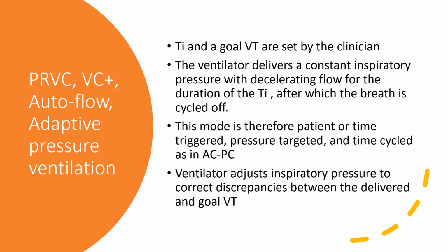So the point is this: it's a lung protective strategy. The inspiratory flow is variable based upon the needs of the patient, and a lot of people find these particular modes of ventilation to be quite good in the ICU because it delivers lower pressures to the patient. It targets the tidal volume you want to deliver. It targets the minute ventilation you want to deliver, and it does it at a safer way of delivering pressures rather than overly inflating the lungs. The downside to this, tidal volumes could vary breath to breath. That's the only downside.